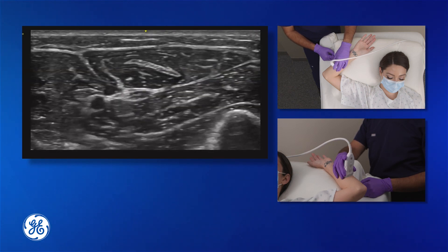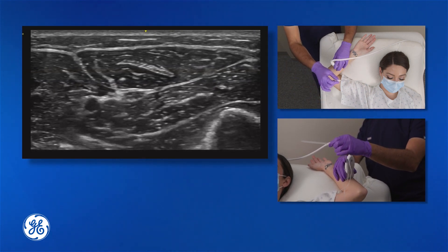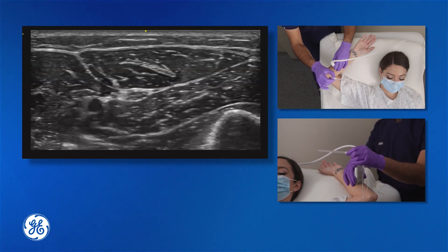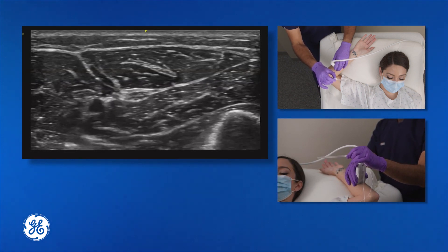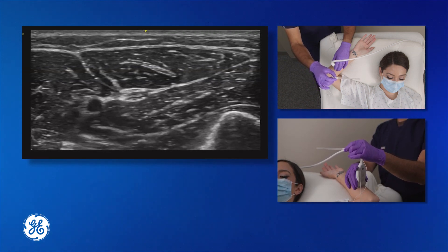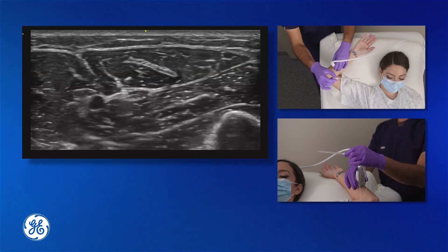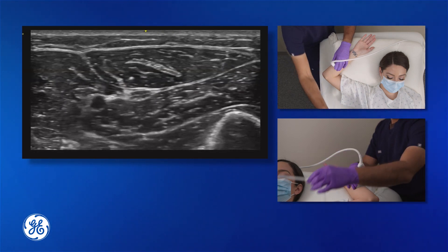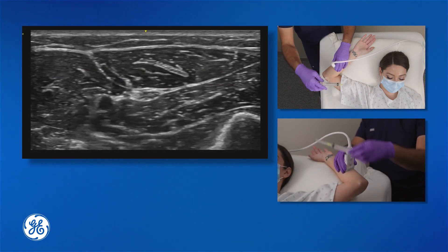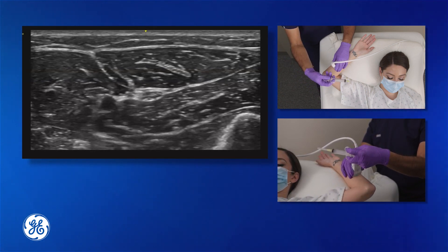Now we'll discuss some of the equipment you can use when doing the block. A nerve block needle can be used to easily guide the needle into place. However, the problem is that this requires a second operator for injecting the anesthetic, because the operator performing the ultrasound and guiding the needle doesn't have a spare hand to inject. In blocks performed at the forearm, because distances are less deep and more shallow, a standard 27-gauge needle of one and a half inches in length attached to a control syringe allows for single operator operation and better control over the procedure.